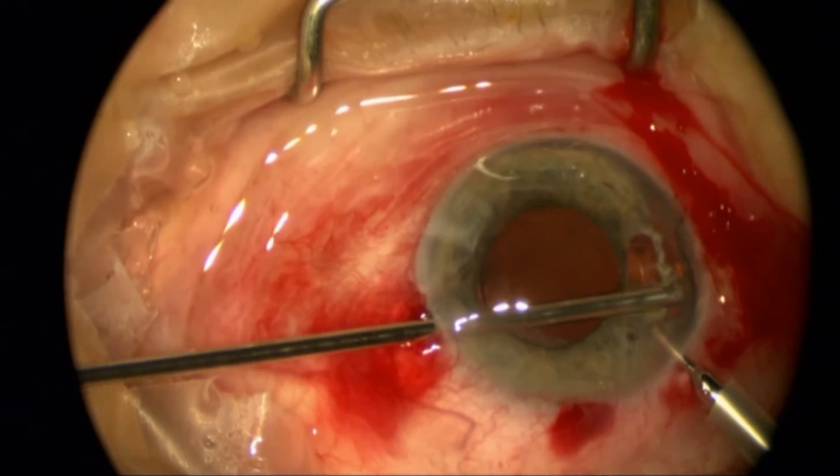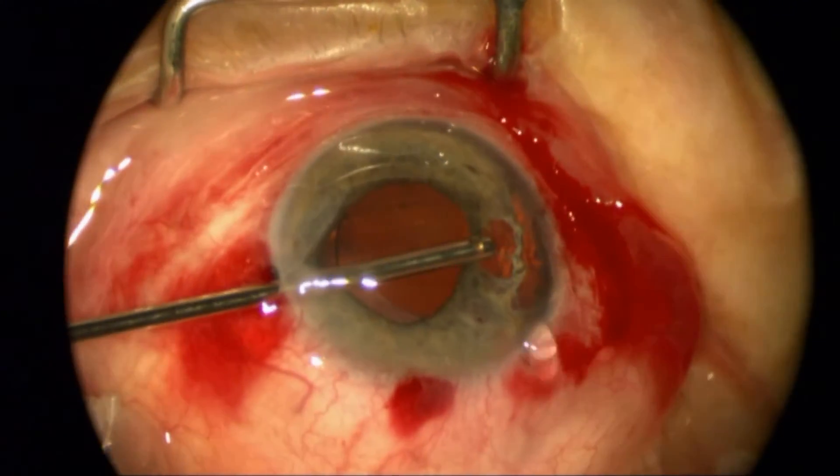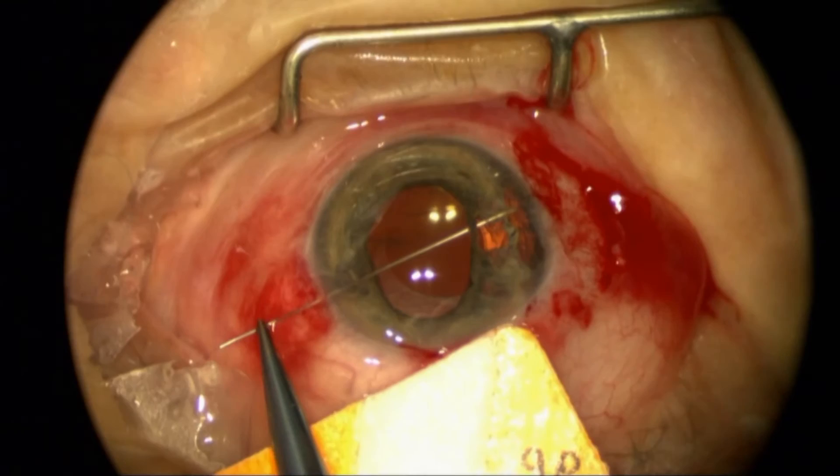Here I'm putting in more viscoelastic and removing vitreous that's coming around some of the injured area, which also has some zonular weakness. I didn't need a capsular tension ring, but I was ready to use that if needed.